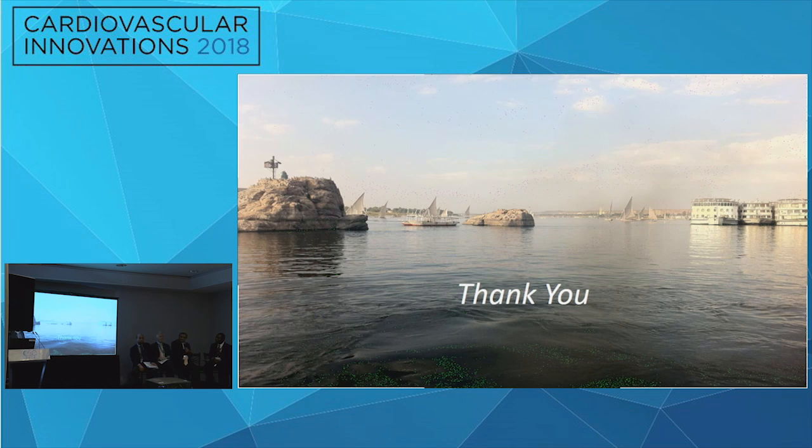Thank you. So again, this is a prime example of a long distal cap bifurcation. This is where what we used to do in the early days, antegrade wire escalation or knuckling, wouldn't work. And you saw then when you lost the RPL how sick the patient got. So you really want to preserve branches. The other thing about the right coronary, you cannot knock off RV branches.